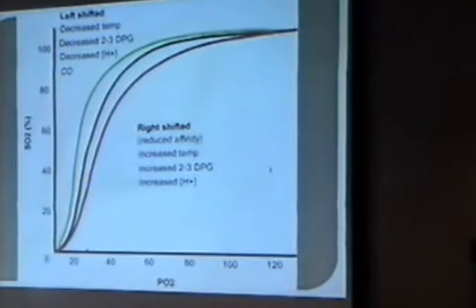For the baby, the saturation on the monitor will be higher because the baby has fetal hemoglobin, unless you transfuse him a lot. Okay, while the blood gas machine will plot it, it does not measure saturation unless you have something called a co-oximeter. It actually measures oxyhemoglobin. But the regular blood gas machine puts it in the curve for adult hemoglobin. So you'll get a reading that's a little lower because it's shifted to the right. The adult hemoglobin curve is shifted to the right, so it has lower saturation at the same PaO2.